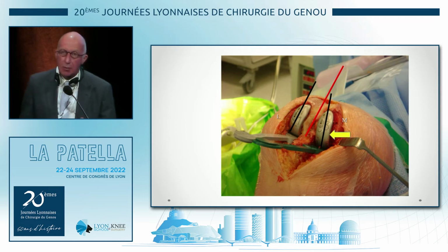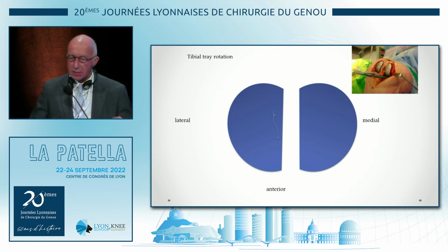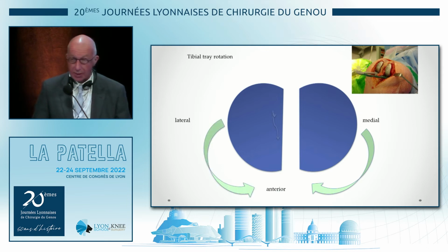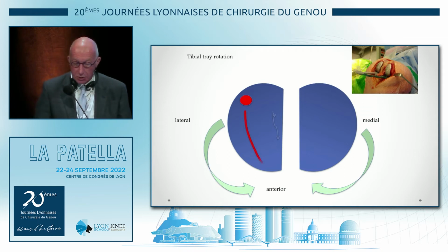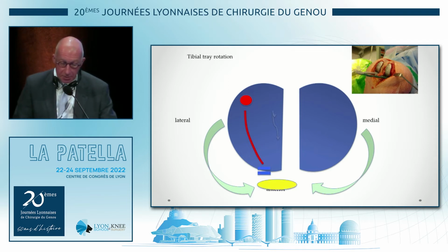On the medial side, I will make it more to the midline to address the kinematics, but on the lateral side, I will put it as far lateral as I can to address the kinematics of the joint. And you can see why that is. This is a view from above, and you can see that on the medial side, I want to externally rotate the tibia. On the lateral side, I want to internally rotate the tibia because of the kinematics. On the lateral side, from flexion to extension, we will see the kinematics bring the contact point inwards. And that will be just behind the patellar tendon.